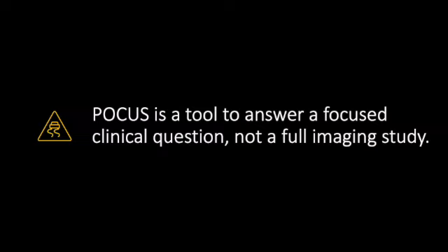Have you memorized this slide yet? Remember, POCUS is a tool to answer a focused clinical question, not a full imaging study. This is particularly applicable when considering which patients are appropriate to examine using bedside echoes and being able to understand the limitations that these studies have when compared to comprehensive full echocardiograms.